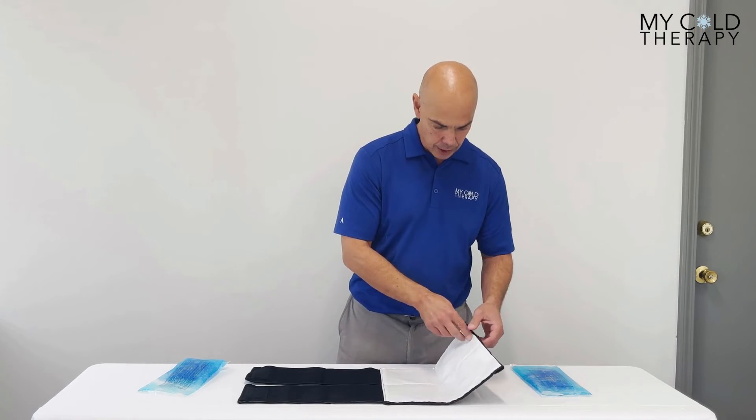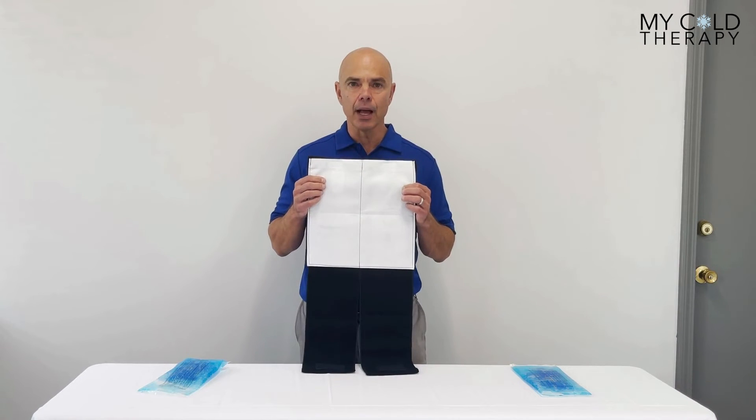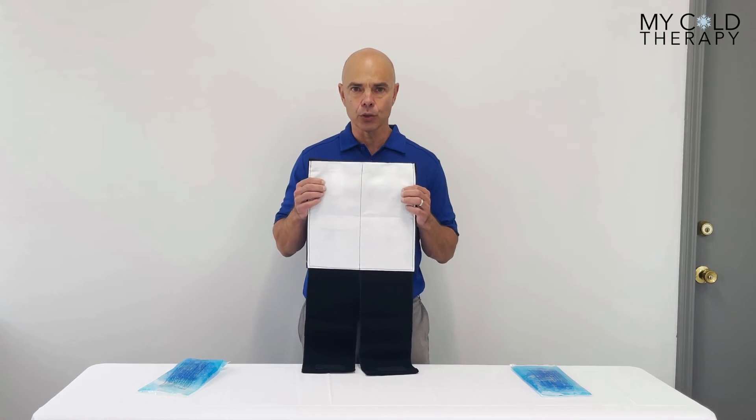They Velcro tight. The white part of the wrap allows you to put this directly on the skin, so you do not need a skin barrier — it is the skin barrier.